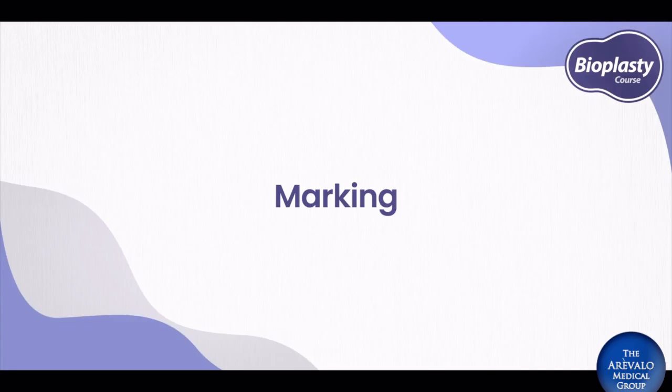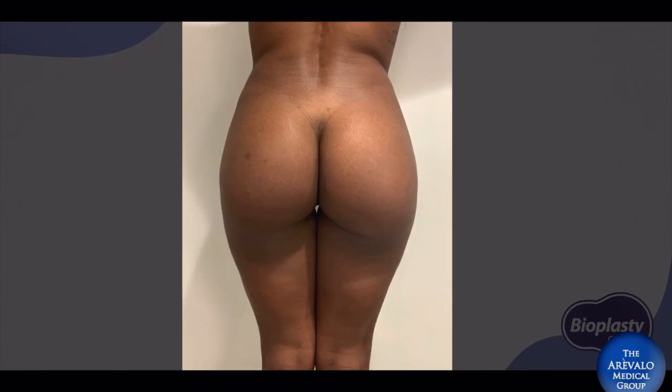Marking. This is one of the most important parts of the gluteobioplasty. Using the ruler, we draw a line of approximately 7 centimeters. Then we place the gluteal marking mold and trace its outline. Connect the horizontal and vertical marks and number the quadrants 1, 2, 3, and 4. Repeat the process on the other side. Remember that the mold can be moved up, down, or even from side to side, according to the need for correct position on each patient.